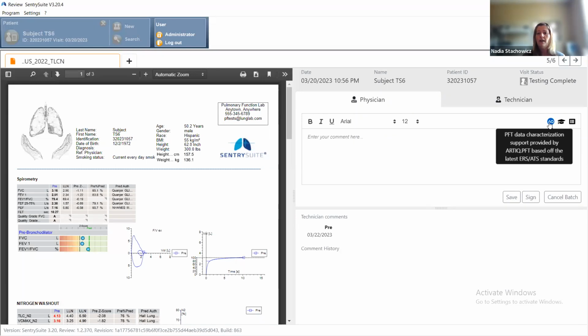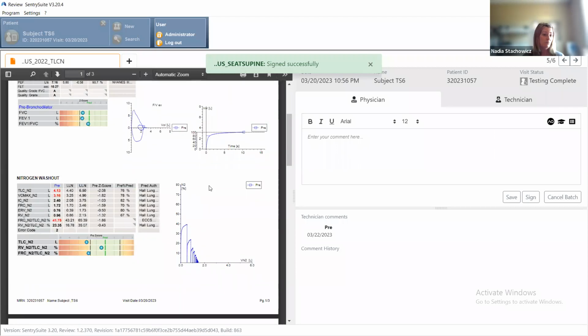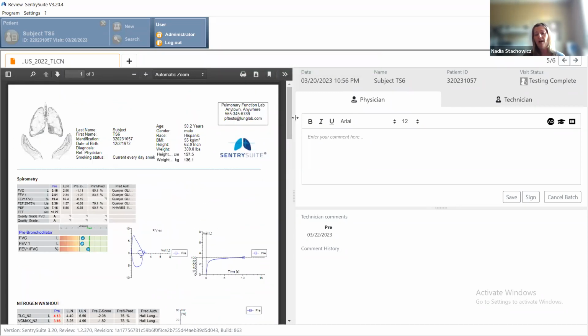And on this one, again, you could really use this tool in whatever way you like. You could just scroll and look first, or if you're learning, you could have those guidelines in your sys tray of your computer or next to you in a document, and then go through it that way. So really just supporting you to move through this. Simple restrictive lung function, mild restriction with normal diffusion.